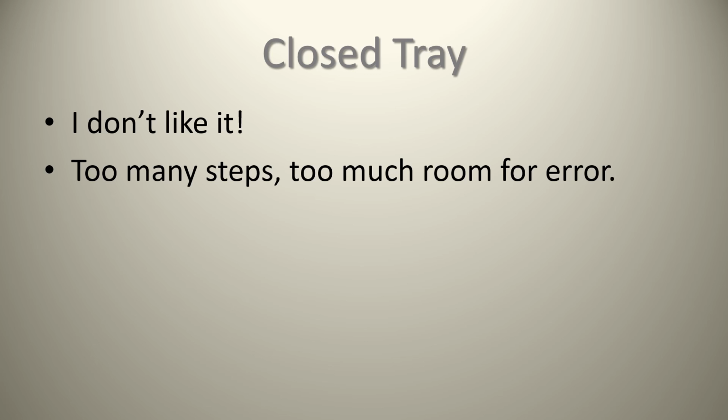It's a little bit better now than it was in the old days. In the old days, they actually used to have you screw the impression copings into the implant, take your impression, unscrew it, and then basically pop it right back in the impression, for which I was like, oh boy, how do you know this thing's actually going back exactly where it's supposed to be?